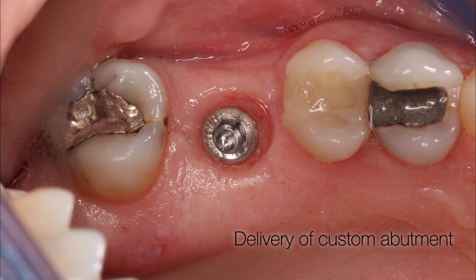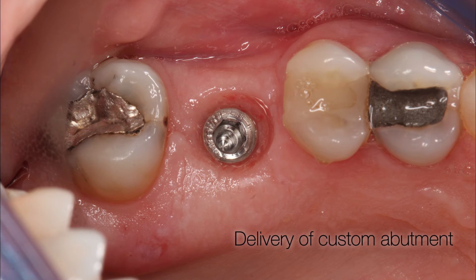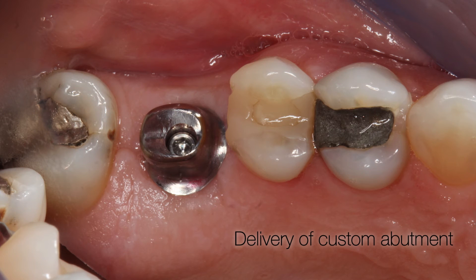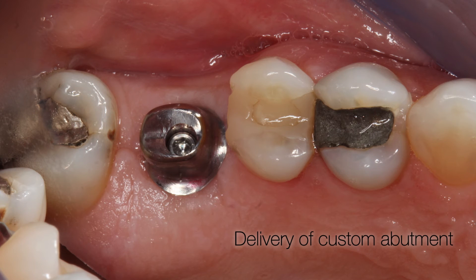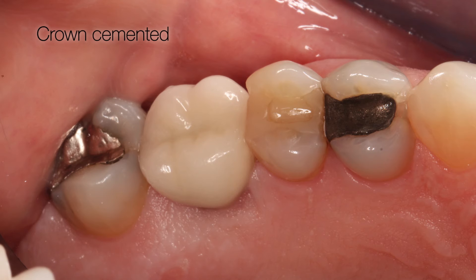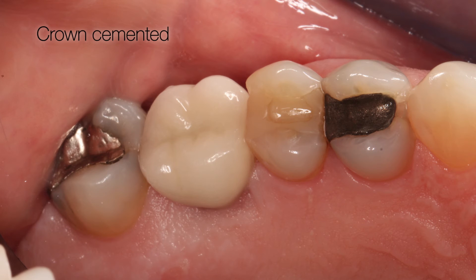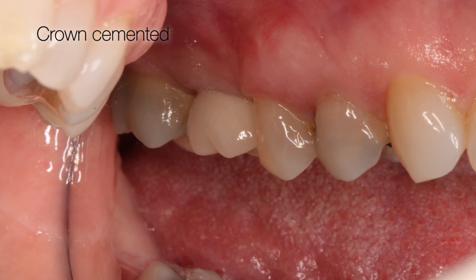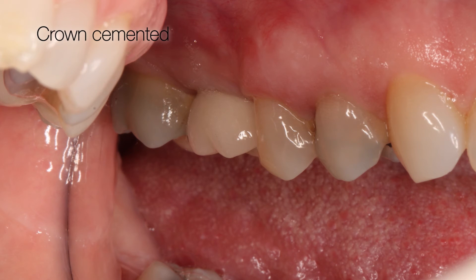The implant crown delivery is as usual: place the custom abutment, tighten to final torque, and cement the crown. Now we have a nice implant restoration through our Carestream 3500 scanner protocol.